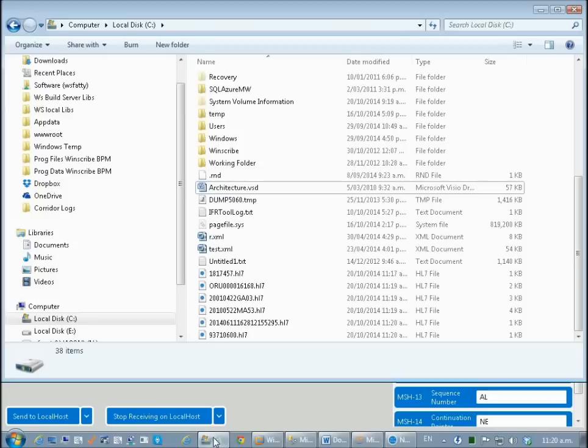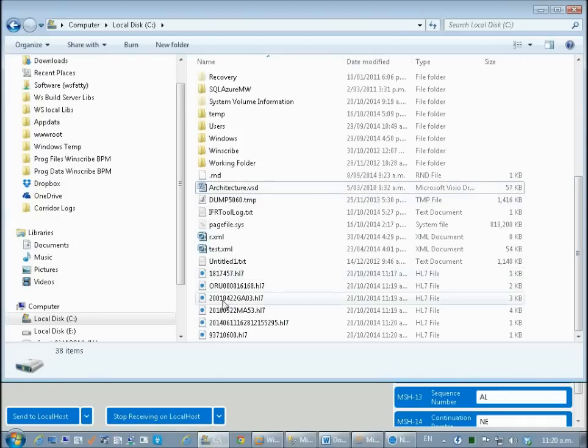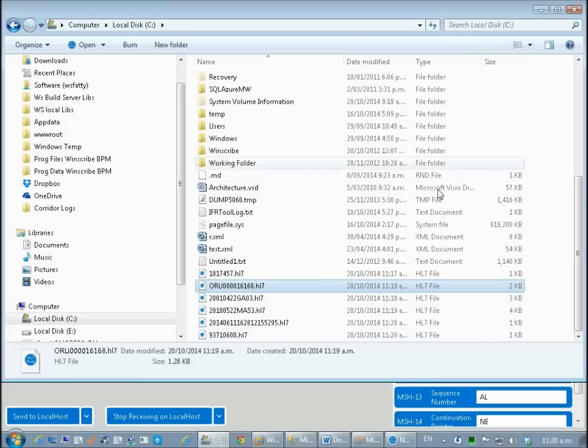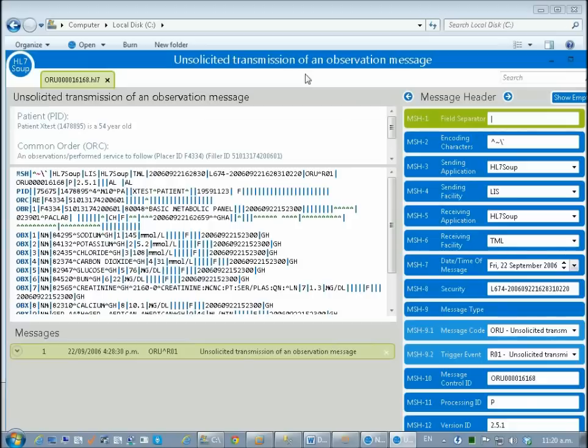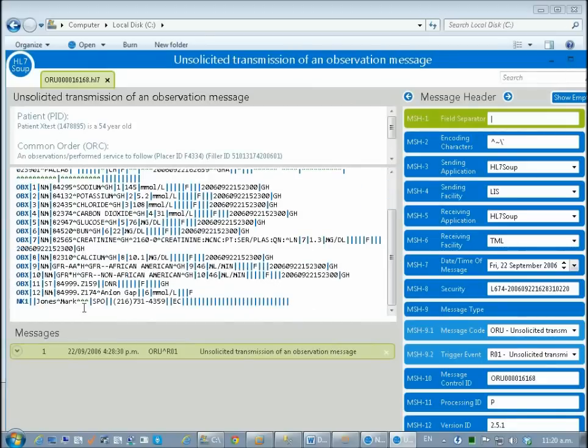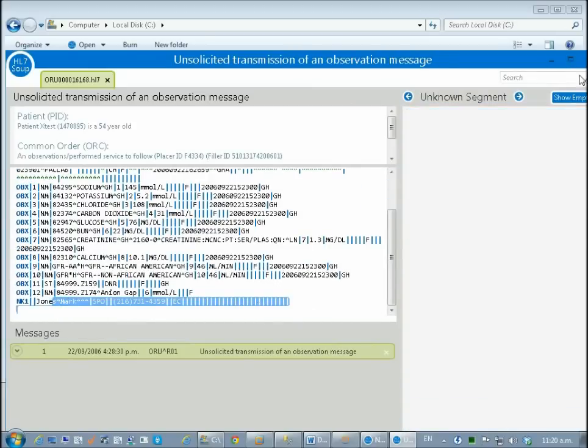We should now also be able to go to my C drive and we will see if I scroll to the bottom these new HL7 messages that have been created. They've got the control ID as their file name and they are now loadable up into the other application. If we scroll to the bottom of those we'll see our next of kin information stamped onto the bottom.